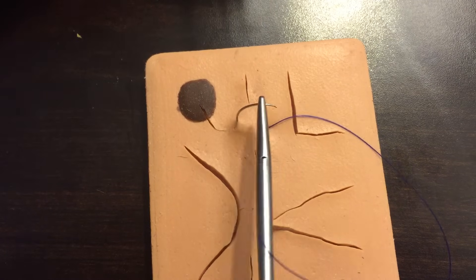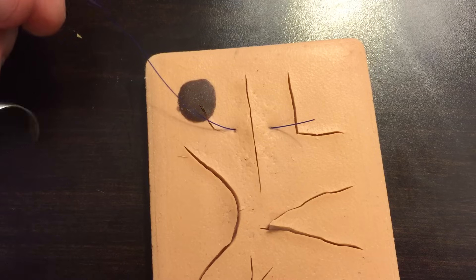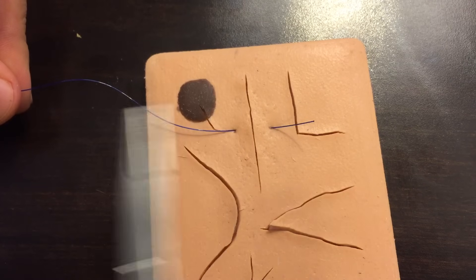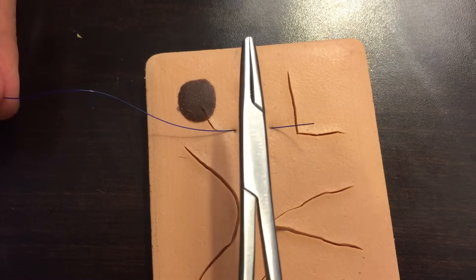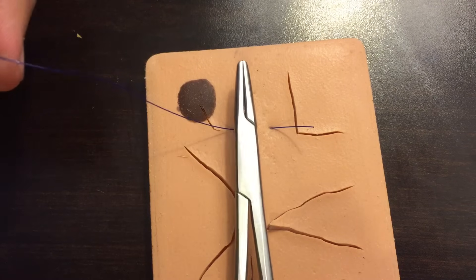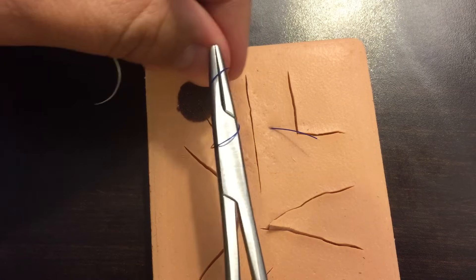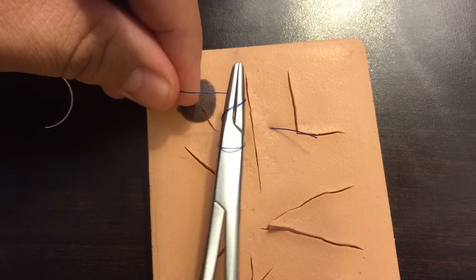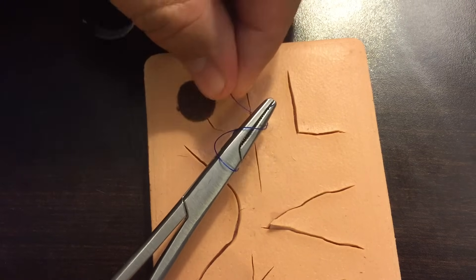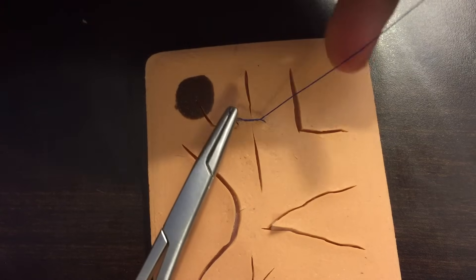Pull the rest of the suture through, being careful not to pull it all the way through. Then we do an instrument tie: keep your needle driver inside the V made by your suture. With my hand I'm going to wrap around the needle driver two times — that helps create some tension as I'm pulling tight. Then open the needle driver, grab the tail, and as I pull it across, use my pulling hand to pull it off the needle driver.